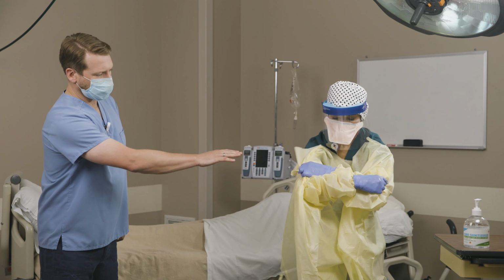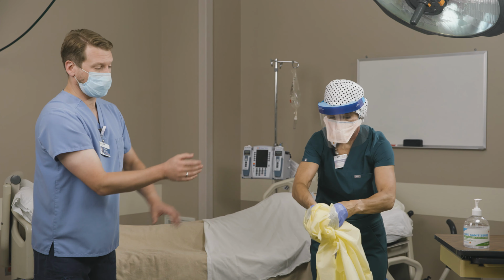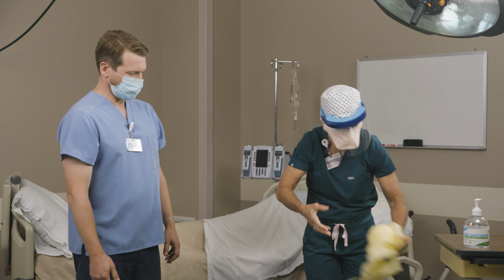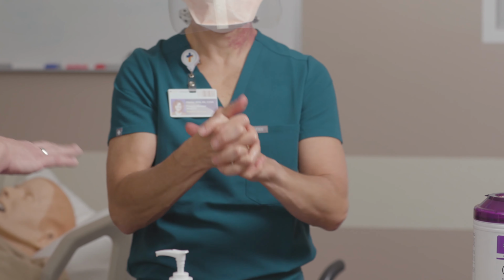And notice, be mindful that she leans forward and lets the gown fall so she can roll the ball up so that the outside of the gown gets contained on the inside and dispose of in the trash can. Krista will perform hand hygiene and then she'll exit the room.